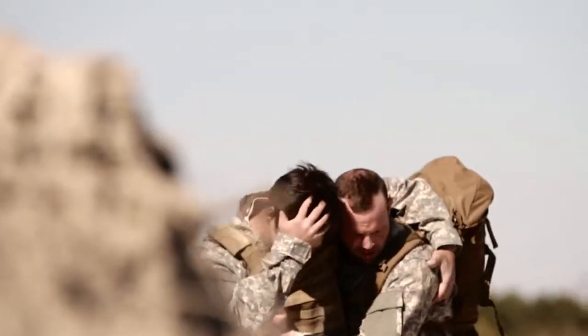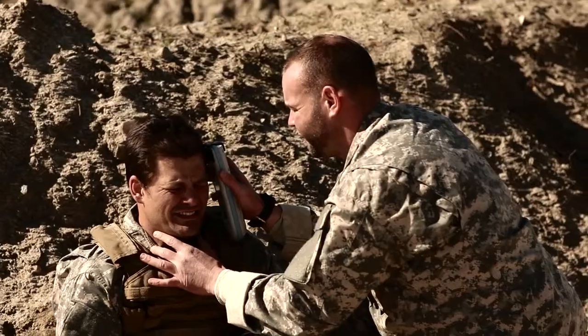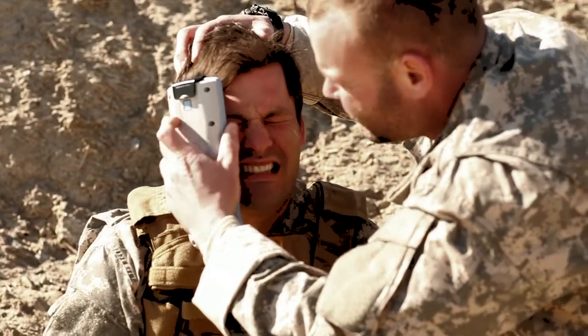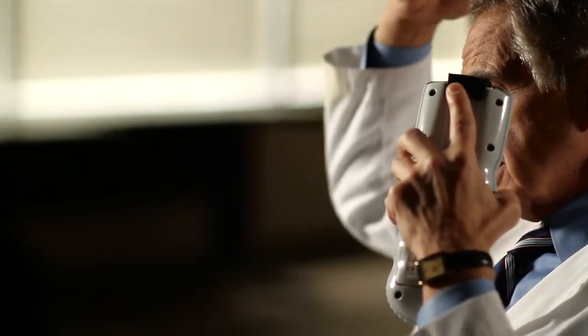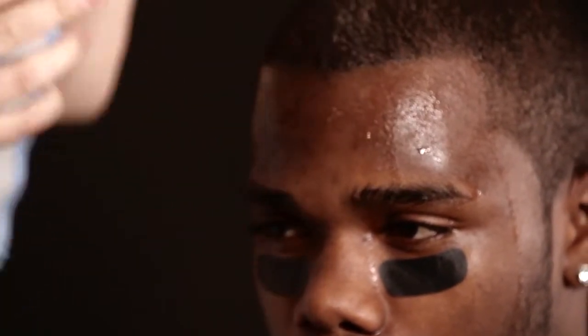When there is a direct abrasion or laceration on the scalp, do not place the probe in the wound. If there is blood or mud, wipe it away and move one centimeter to the left or right, maintaining symmetry on the opposite side. Since this is a fiber optic system that detects light, in bright light you must shade the probes to some degree so that a false positive does not occur.